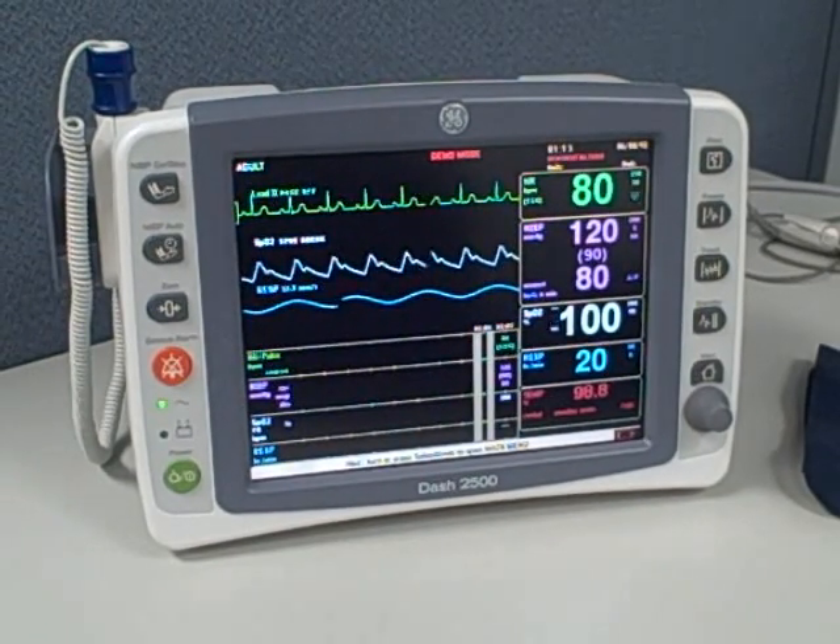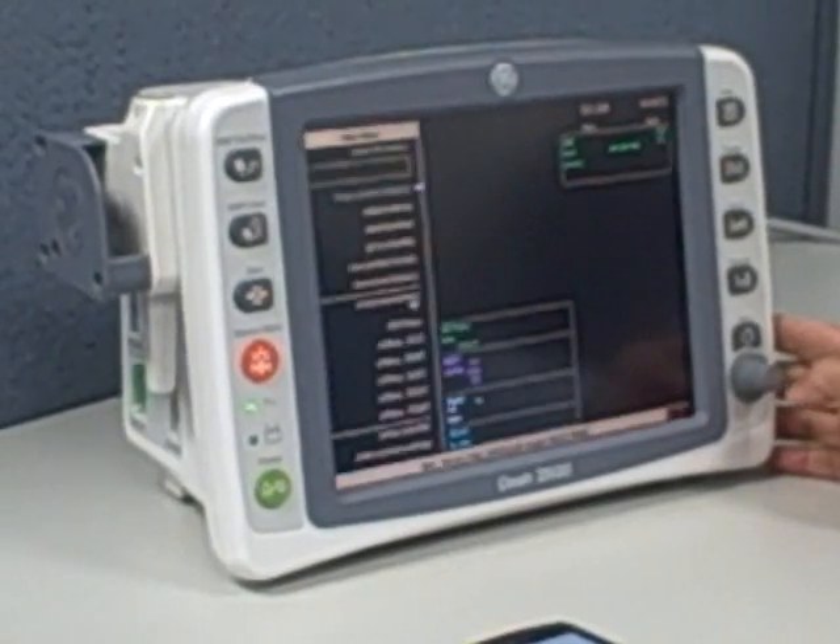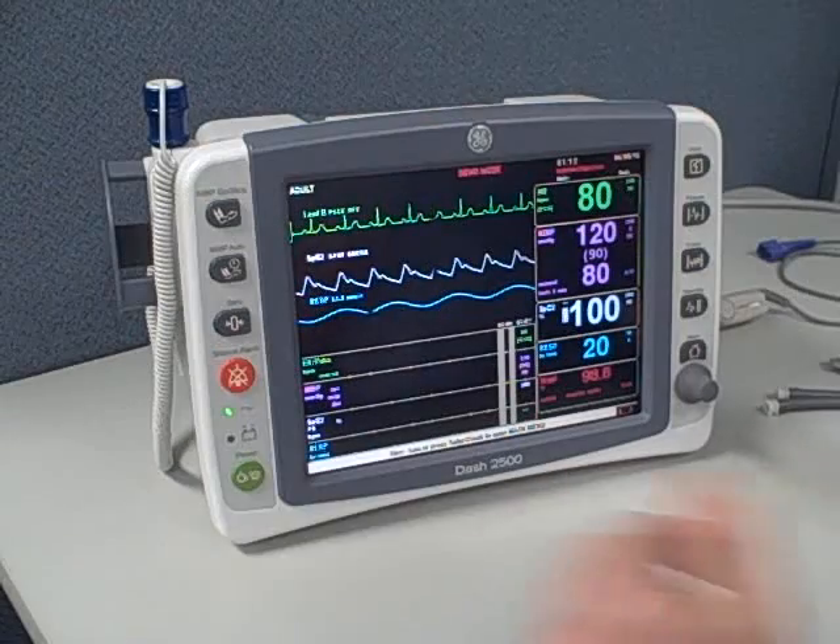Hi, we're looking at the new Dash 2500 patient monitor from GE. The unit performs a series of self-tests when you press the power button.